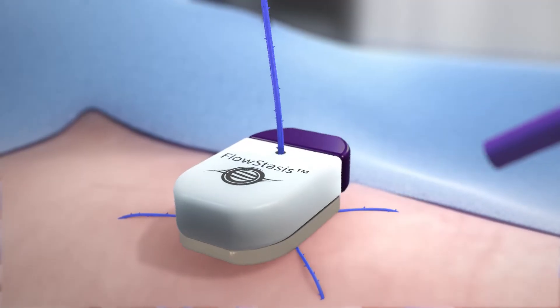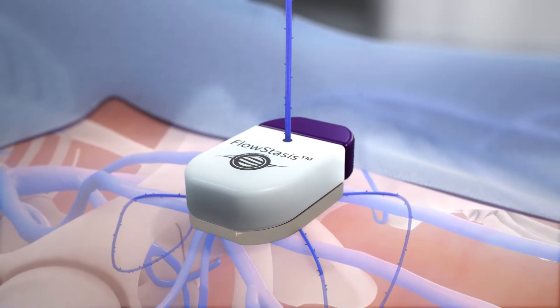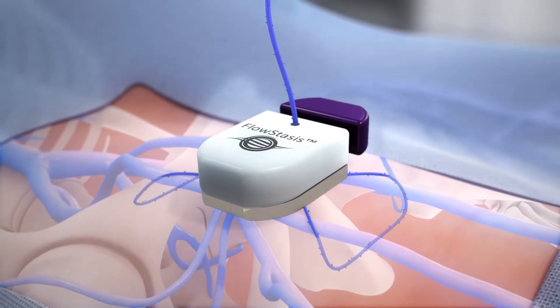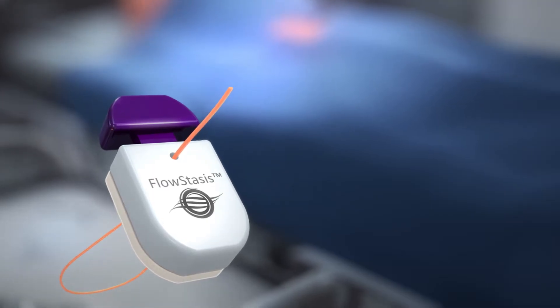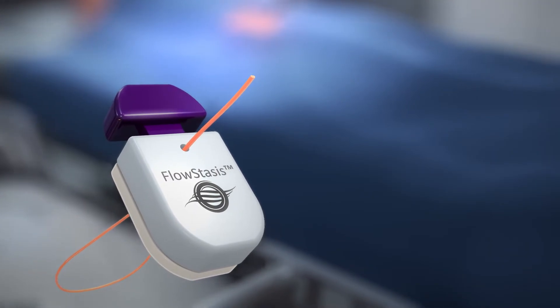The Inari Medical Flowstasis Suture Retention Device is a simple, adjustable, and non-obtrusive solution for large-bore access sites. Following mid-bore and large-bore percutaneous venous interventions, Flowstasis builds upon standard suturing techniques while optimizing workflow.